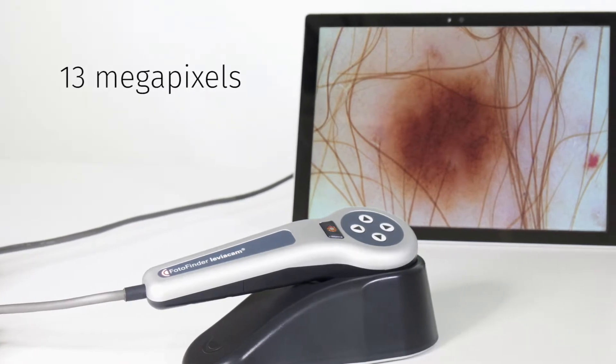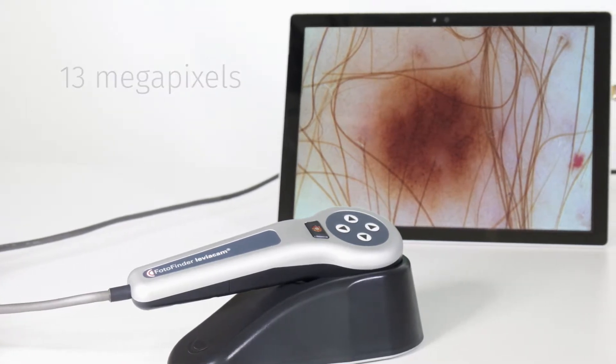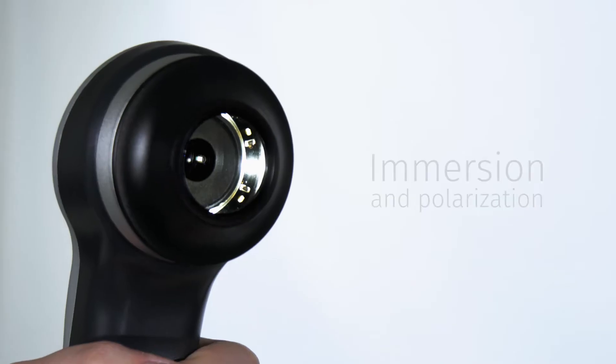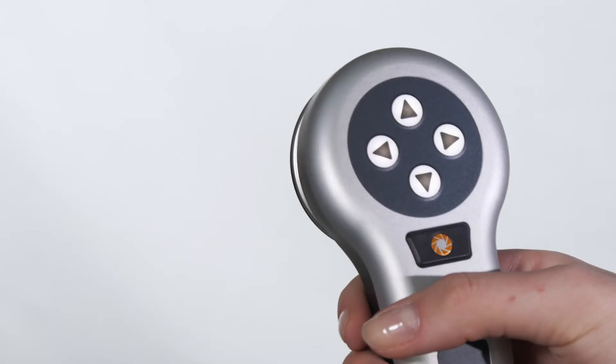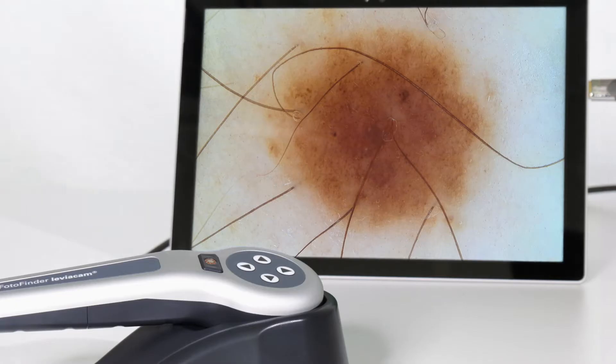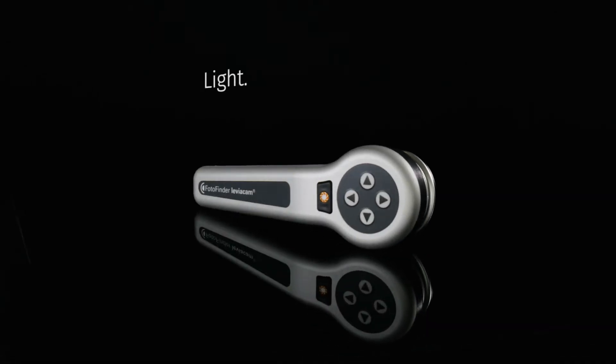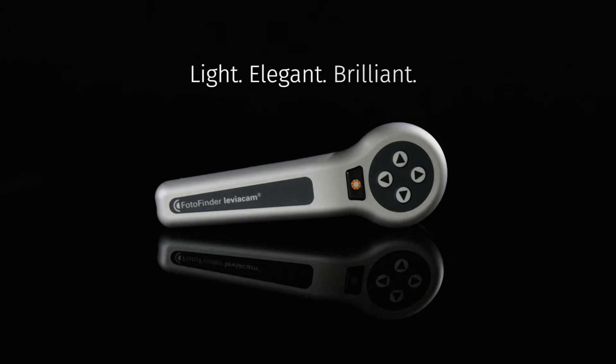13 megapixels — visualise skin perfect. The magnetic optics deliver brilliant micro-images for immersion and polarization, with autofocus and intuitive control. This is photo finder quality: the most elegant and brilliant USB dermatoscope worldwide.